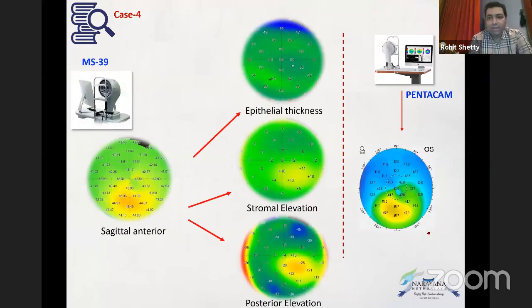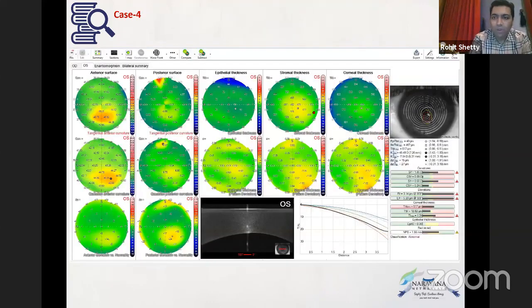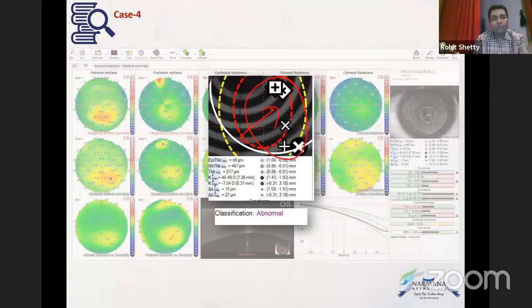For example, let's look at this. This is a scan of a keratoconus. You can see that epithelium is thinned out here, but that is a stromal elevation, huge elevation, matches to the posterior elevation. So the epithelium is thin, stromal, this is KC. So what happens is it helps us to understand what is really happening. And you can see in this map, all your points are inside your red area. So this is a very important feature, very important software point, which helps us to look at what is happening.